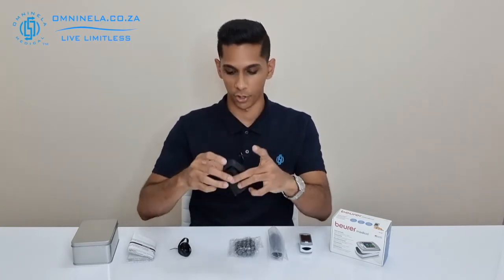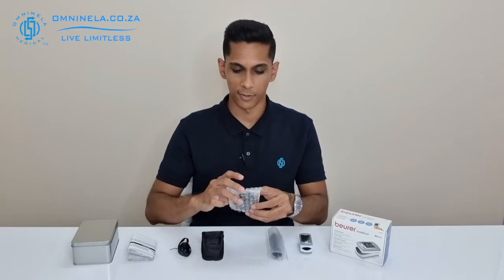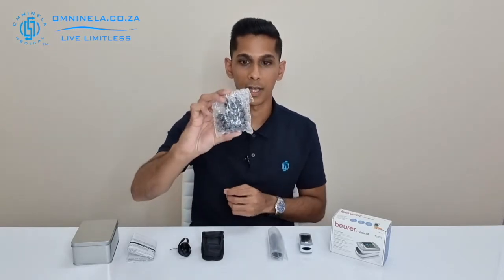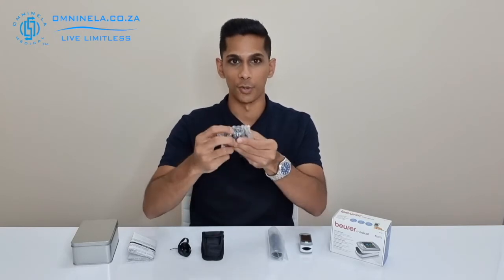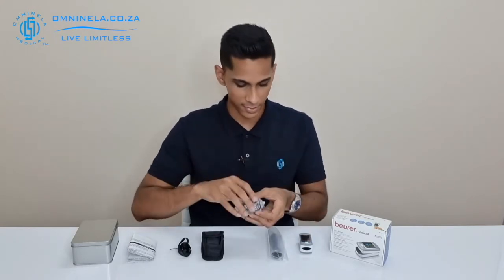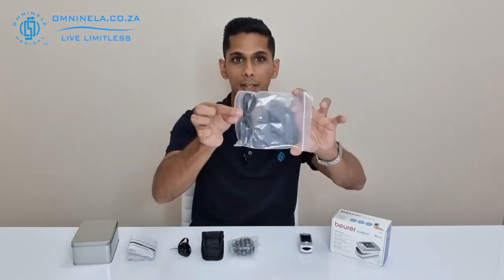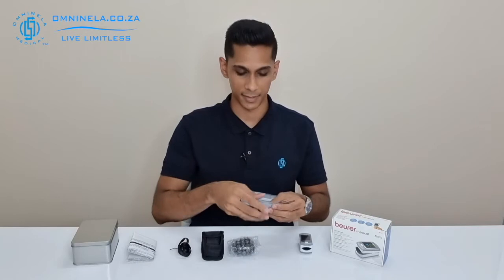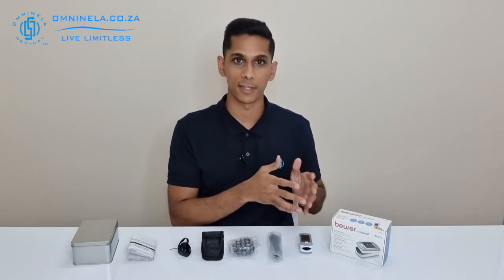Next we can see the two-pin plug, which will allow you to charge the device via the USB outlet on the back of it. Next is the USB cable itself, which will allow you to do two things: one, charge the battery on the device, and two, transfer data from the device over to your software.